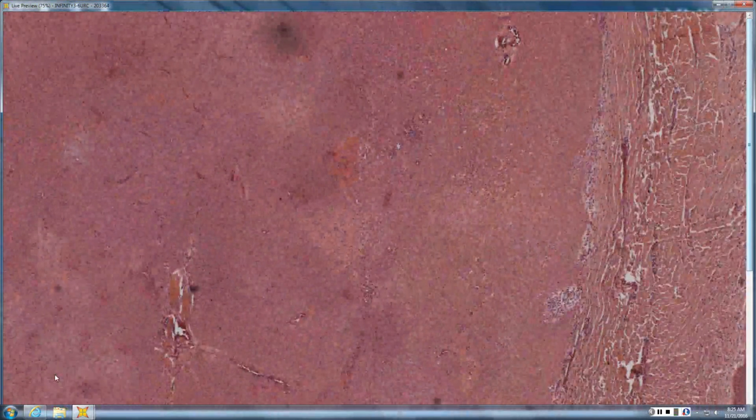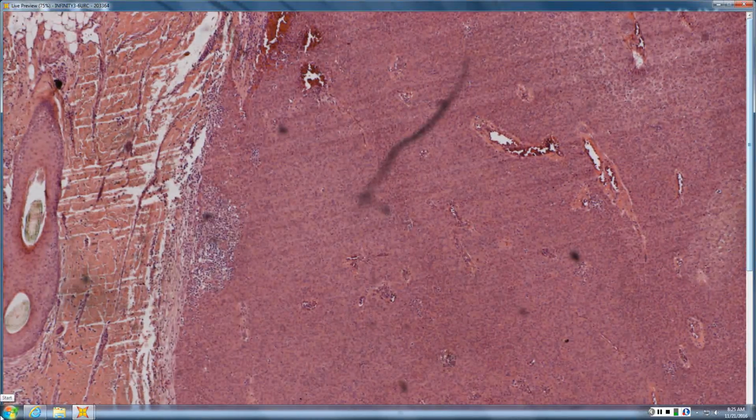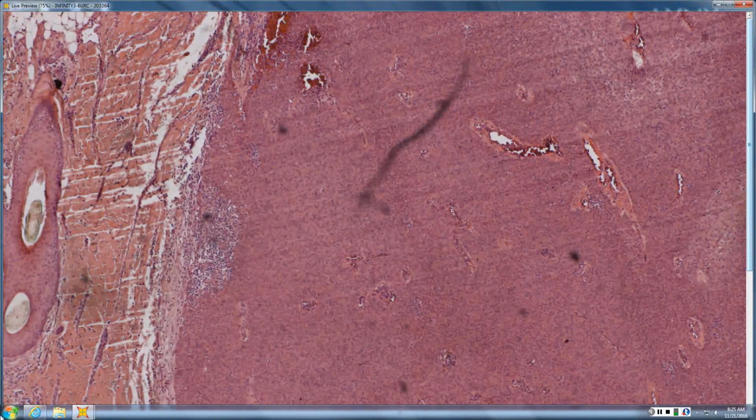It's a big thing. So inflammatory or tumor? Looks like a tumor. You're doing well. And is it nucleus only blue, or does it have lots of cytoplasm around the nuclei? I think there's cytoplasm. So it's red at scan with lots of cytoplasm.